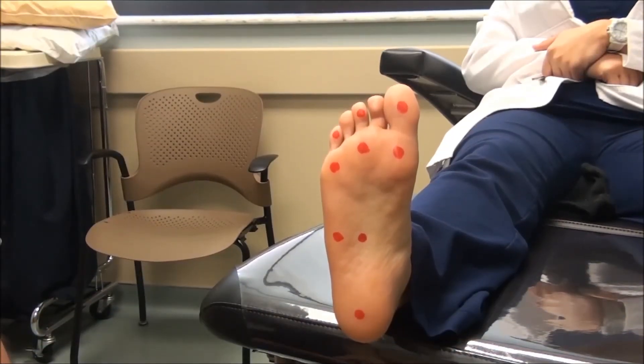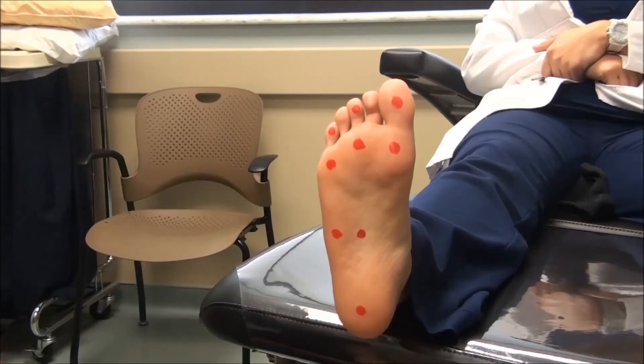This is Dr. Lanzares from 360woundcare.com and today I'm going to be demonstrating the SEMS Weinstein monofilament testing for loss of protective sensation in the diabetic foot. The monofilament test is performed with a standardized monofilament, but the ideal is to use a disposable monofilament, as a reusable monofilament can expose the patient to infection and over time the filament will wear out, leading to less reproducible results.